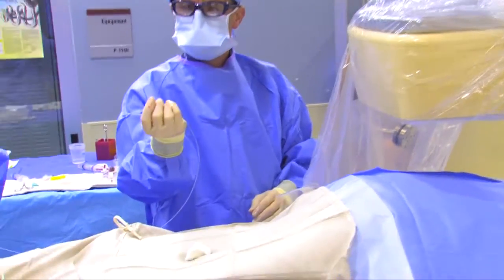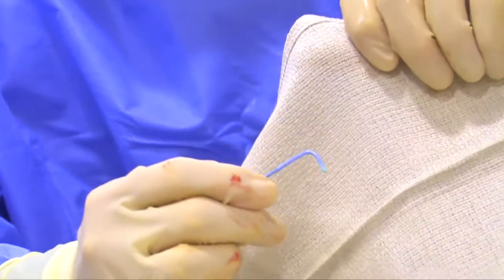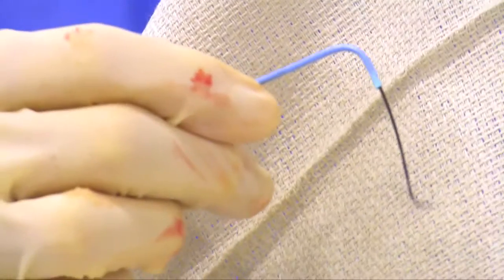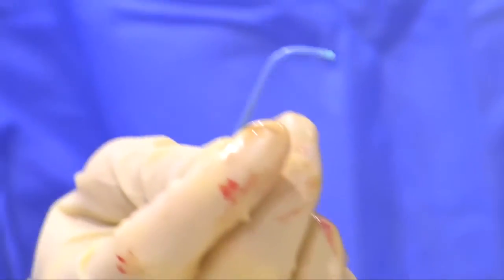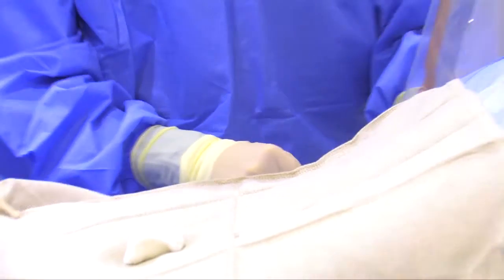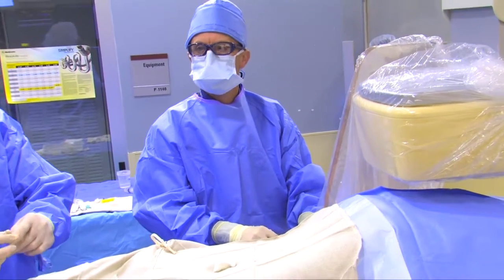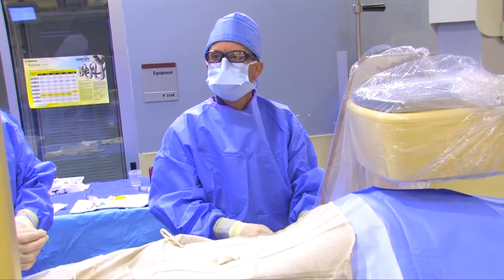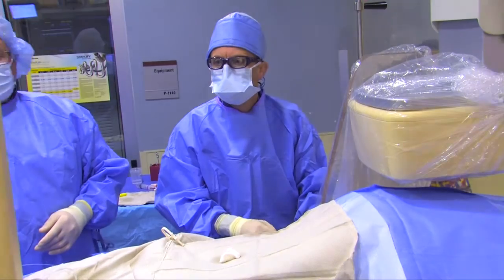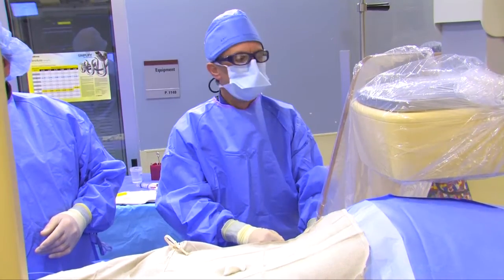Here's the catheter and the wire that goes through it. It's a thin, lubricious wire with a little angled bend on the tip that allows it to find the channel. We look under x-ray as we're going up, and you'll be able to see on the monitor us feeding this wire up.